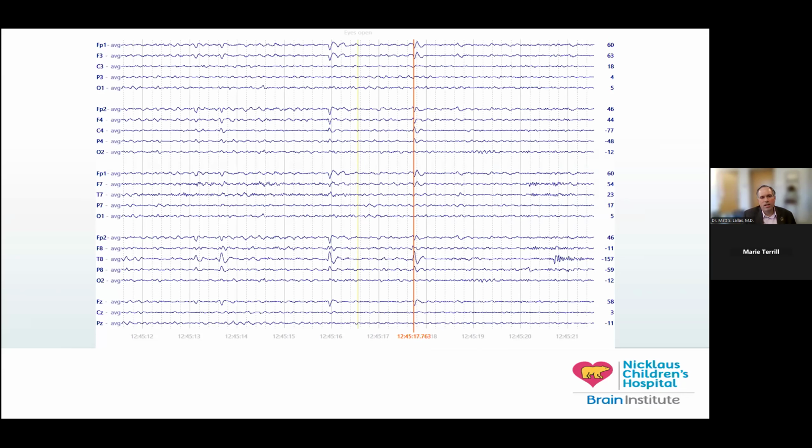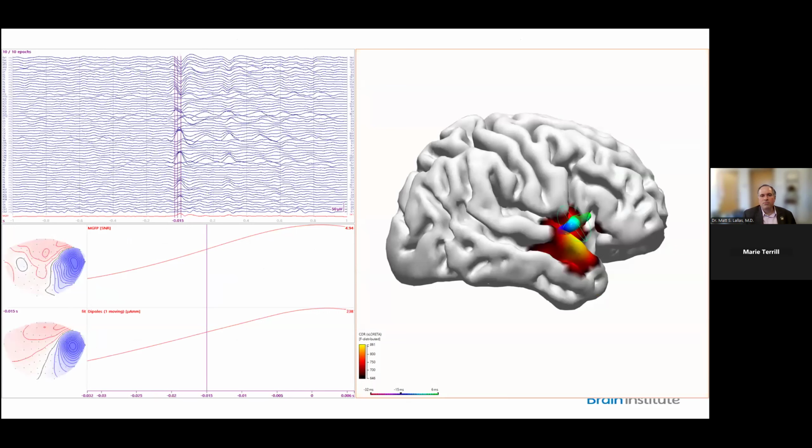So coming back towards the beginning, we talked about this EEG, and I said that all of us are kind of looking at this and in our head trying to understand almost automatically where this is coming from. And so I did that. This is the moving dipole and a distributed model. And if you take a look at it, this is an average of 10 spikes. So initially I found one spike that was somewhat low in amplitude, and I asked the system to find similar spikes. And I actually had to use a low amplitude and not as high of an agreement across them as I would like. And I got this spike here.